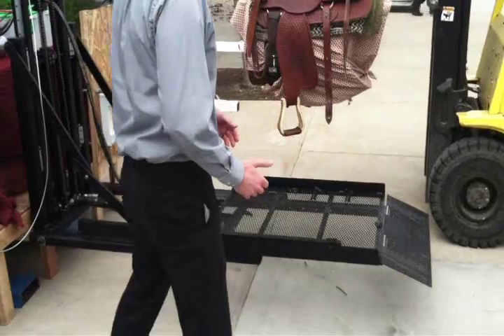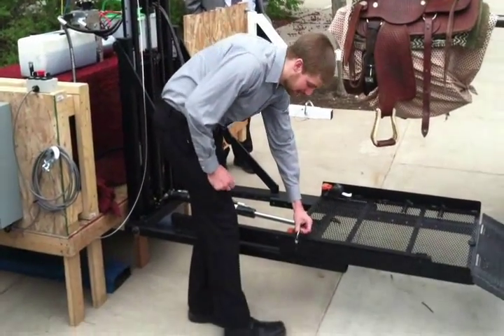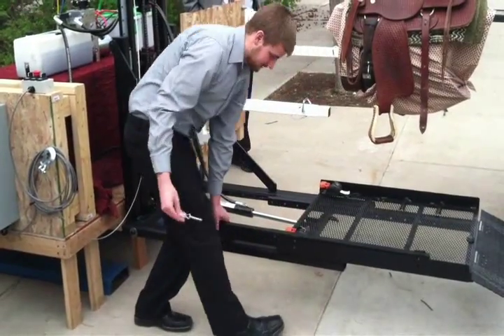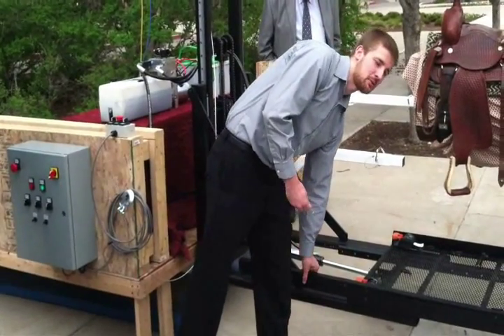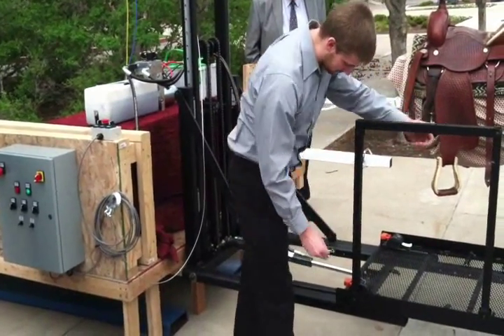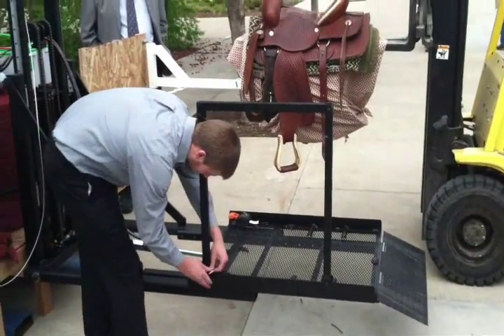For the user themselves to stay safe while operating, we have this handle. It's a simple pin that locks it down and folds into place so that we can still fit within the 6-inch requirement. It simply unfolds, and the pin goes back in to lock it in place.